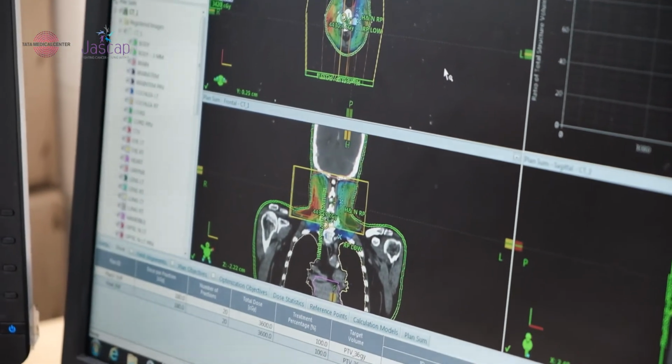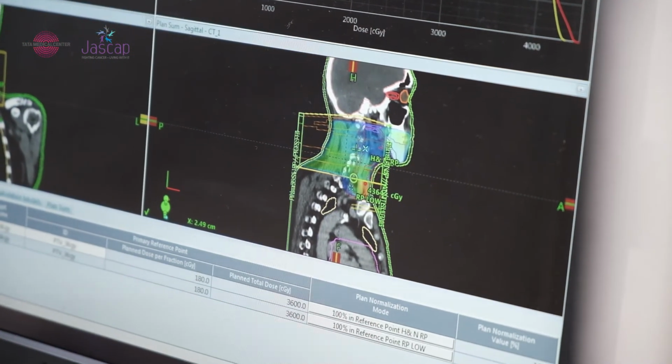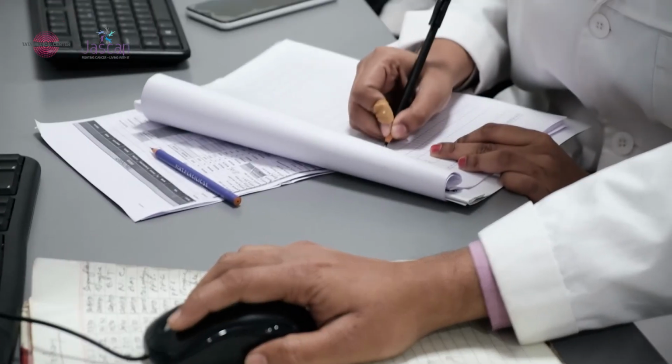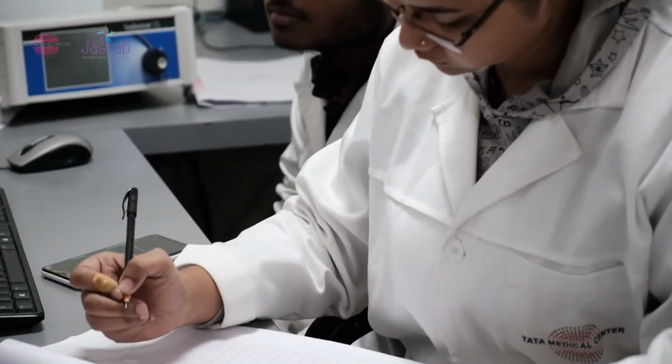During this gap, we work on your images because you are represented by your images in the Department of Radiation Oncology. Our machines recognize you as images, and on those images, it is the responsibility of the treating radiation oncologist to delineate for our treatment planning computers which area is the tumor-bearing area, which is the area that harbored disease before chemotherapy, which is the area that is currently of concern, and of course, the most important sections will be to delineate for our computers, which would compute radiation doses, your normal tissues. Because the goal for any radiation oncologist or treating team is first, we do no harm with radiation therapy.